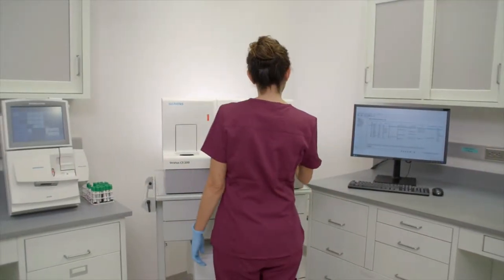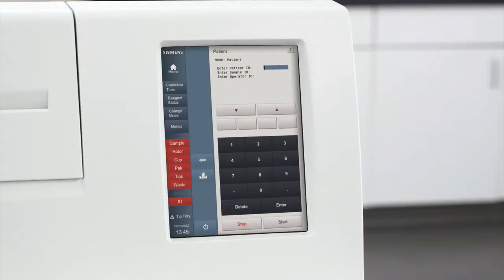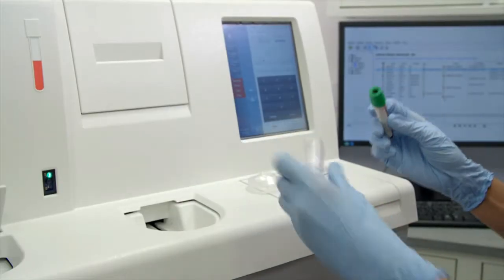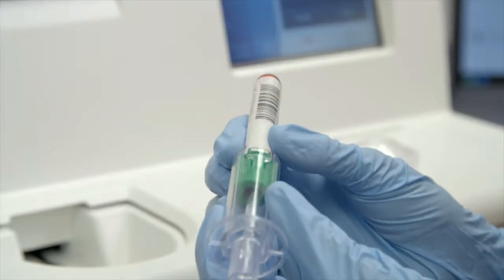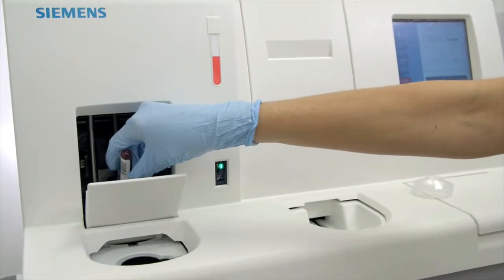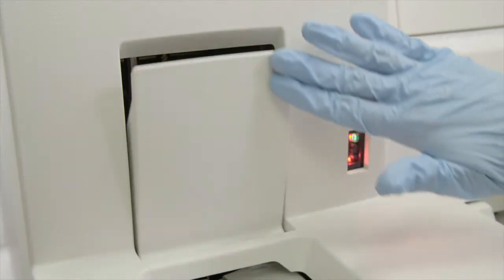Loading the sample is easy too. The Stratus CS200 system has red indicator lights that guide the operator with step-by-step instructions on how to proceed, which reduces the possibility of operator errors. First, locate the cannula, then gently insert the collection tube into the cannula. Then insert the cannula with the collection tube into the system sample door and close the door.